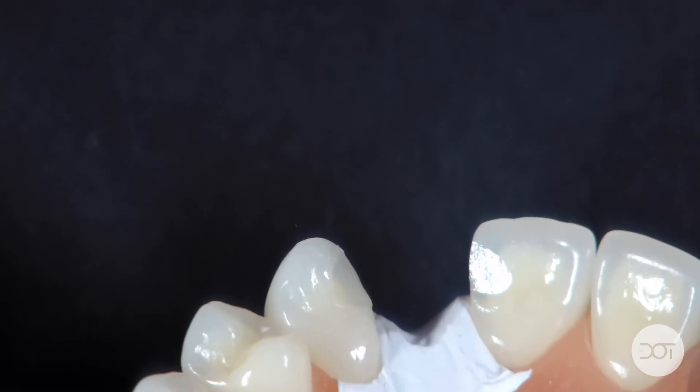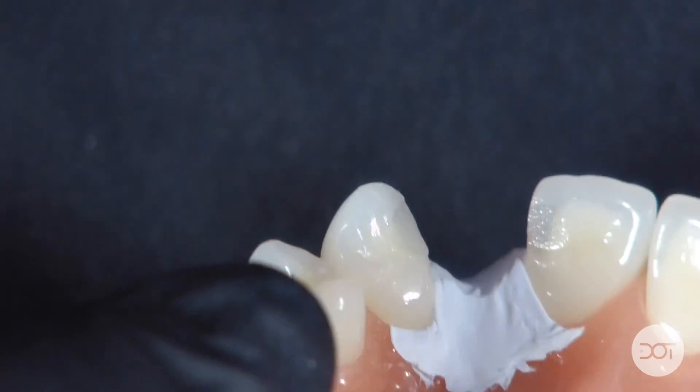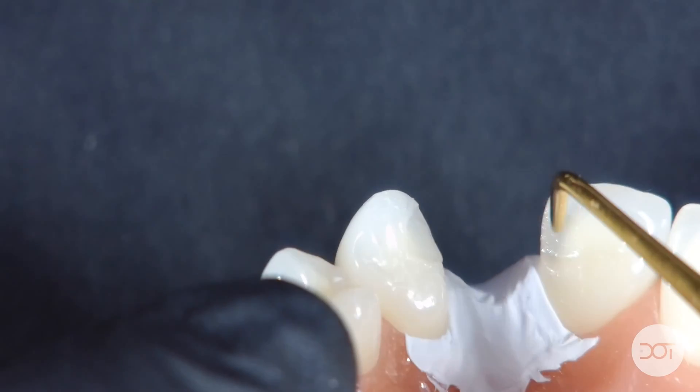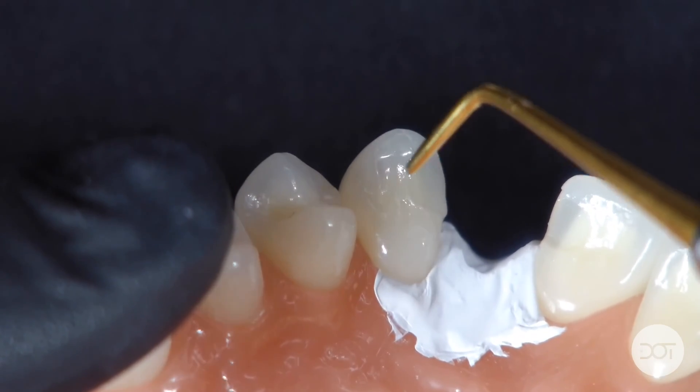On our model, you'll see that the neighboring teeth are already prepared. I've created a preparation in the central incisor on the distal, and likewise a preparation to make room for the rib bond bridge material in the canine area. This is only necessary if you don't have occlusal space — you need at least a millimeter of space for the rib bond material. If the patient has an anterior open bite or the teeth were properly positioned during braces, you may not need to prep. But in a natural class one occlusion, we need to create space to protect the rib bond from normal occlusal forces.